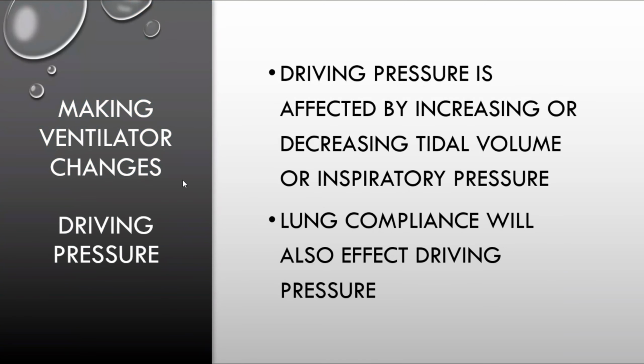And then making changes for our driving pressure. Driving pressure is affected by increasing or decreasing the tidal volume, or inspiratory pressure if we're in pressure control mode. So basically, if our driving pressure is high, then we would want to go down on our tidal volume, or vice versa.